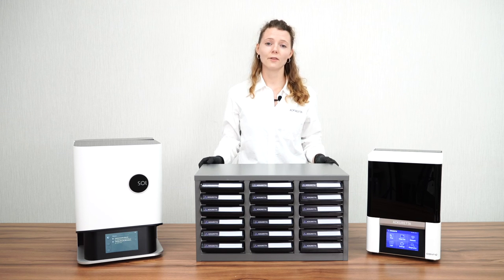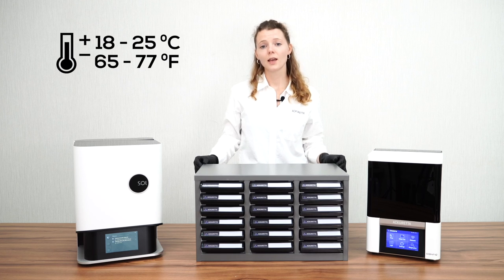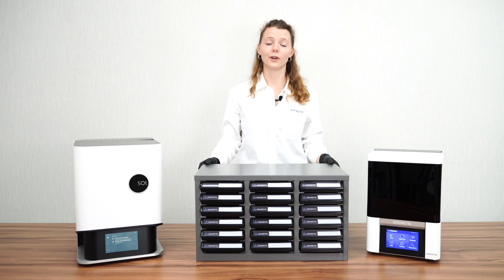This also includes having a good temperature for your resin. That means between 18 to 25 degrees and also a non-humid environment.